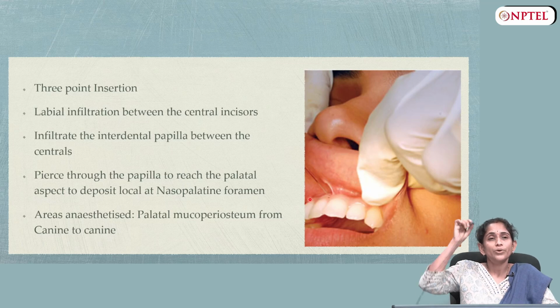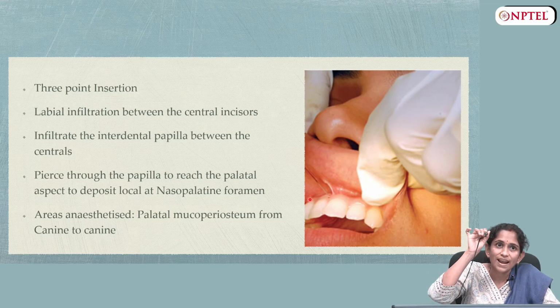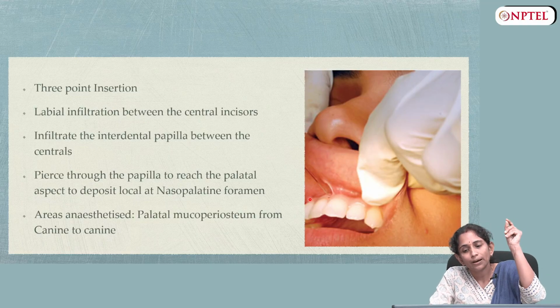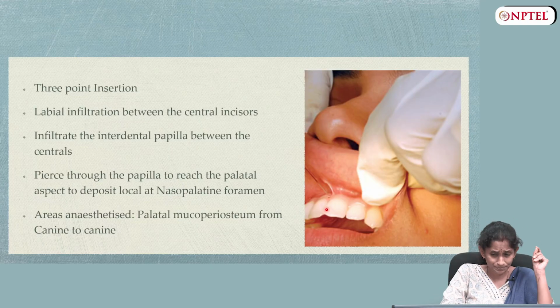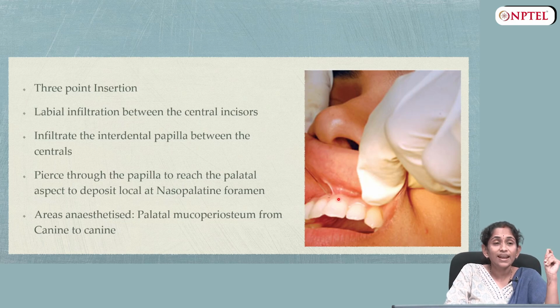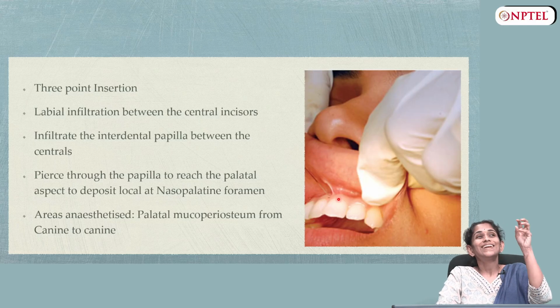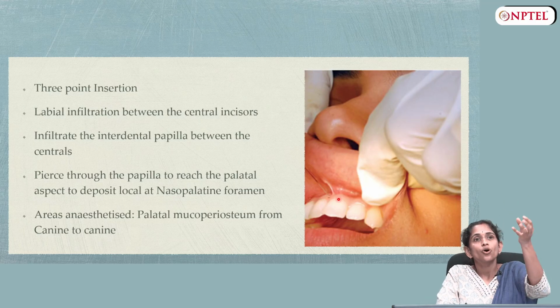So, when you take the needle, insert it and go a little deeper, we come onto the palatal side at the palatal interdental papilla of the central incisors. There you aspirate and inject. So, what does it do? It anesthetizes the region of the nasopalatine foramen.